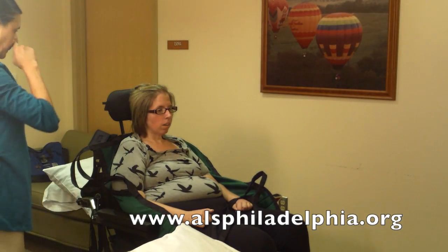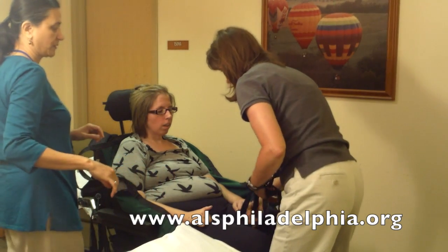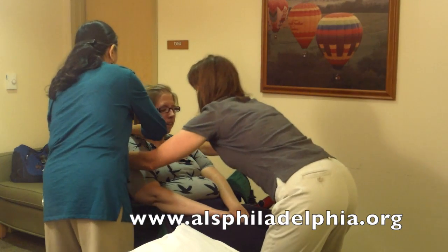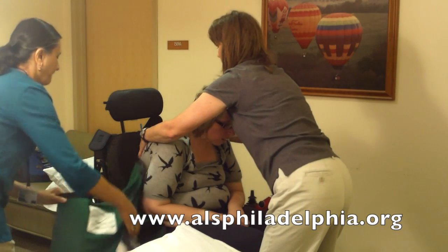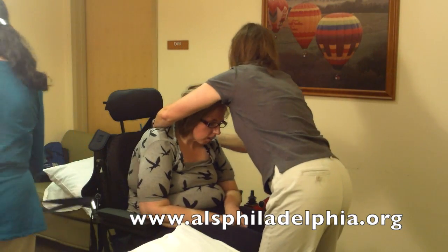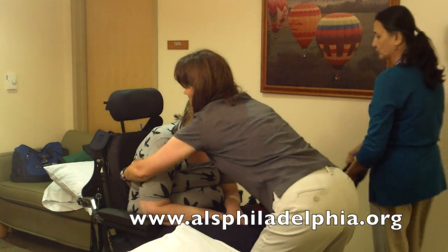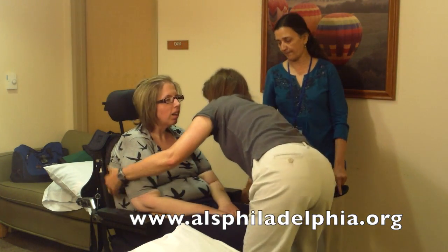Take the loops off, move the Hoyer lift out of the way. At this point you can use the wheelchair controls to reposition the patient and help lean forward to be able to take off the sling. Make sure patient is positioned correctly and comfortably in the wheelchair, and clothing is adjusted as needed.